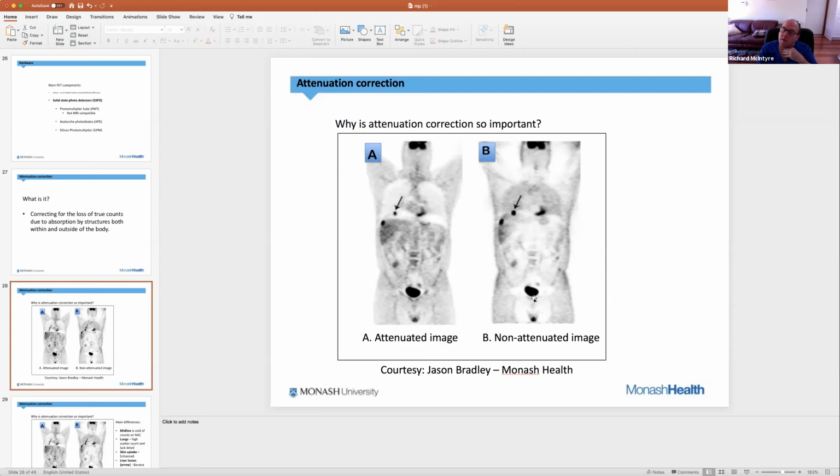So what we have to do is say, okay, if we can get some CT information about these bones and this soft tissue, we can work out how much the radiation from this bladder has been attenuated, and so we can correct for that, okay? And so we can have a standardized model where maybe we can reduce the signal from the heart because we know a lot more has come out through the lungs, and increase the signal relative to the signal in the bladder, okay?